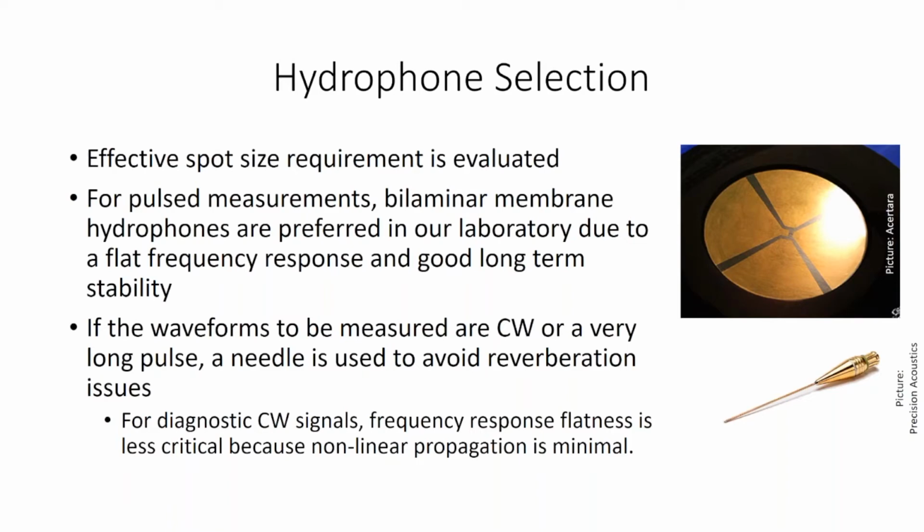We have a hydrophone we have been using in our laboratory for over 10 years, calibrating every few years, and the response has never varied on calibration by more than a dB at any frequency over that period.